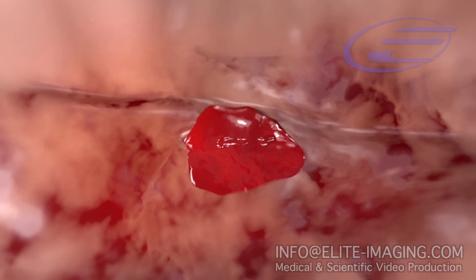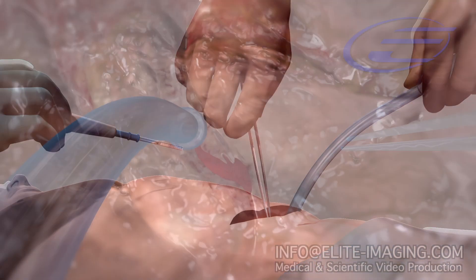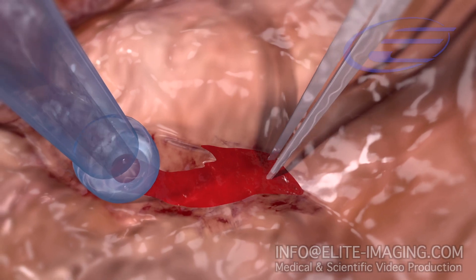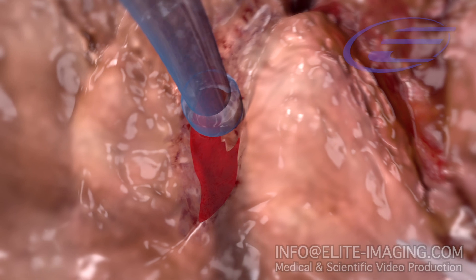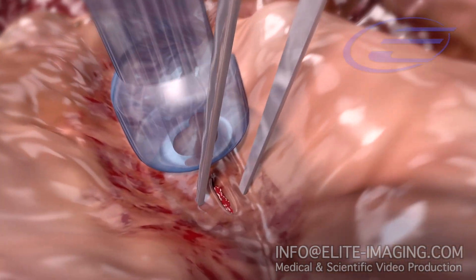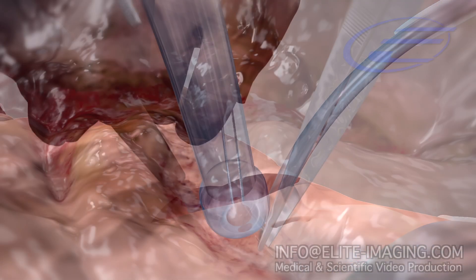Pooling blood can make locating the exact bleeding point difficult or impossible, even with the use of continuous suction nearby. To maintain a dry field, continuous suction must be applied to the exact bleeding point. Forceps can then be used to grasp and control the bleeding point, and finally a third hand applies cautery energy to the forceps.